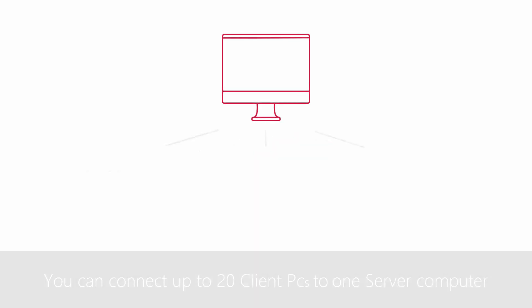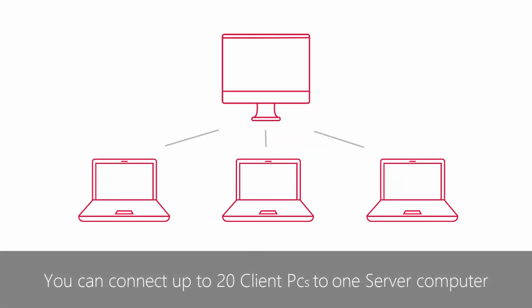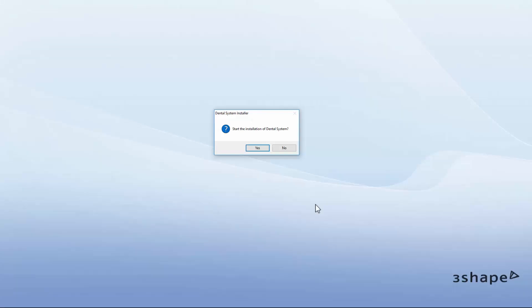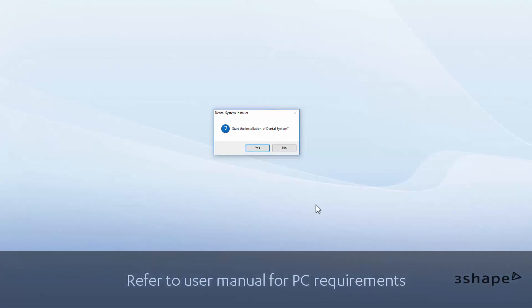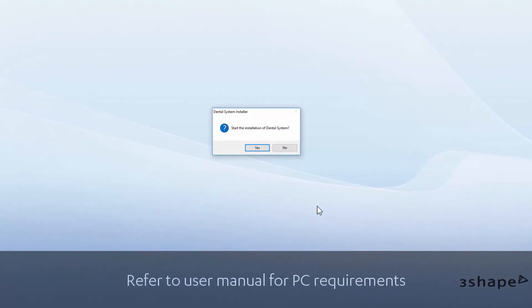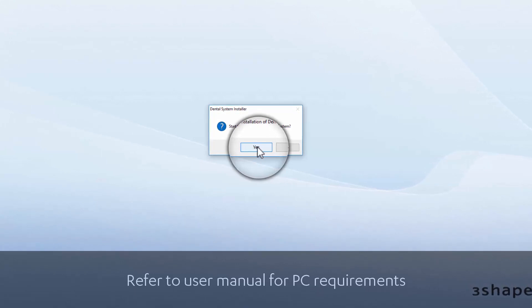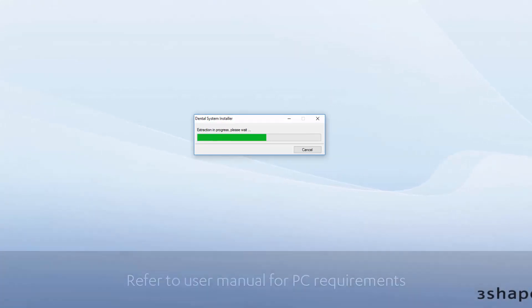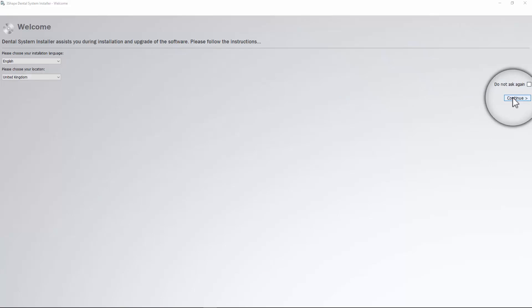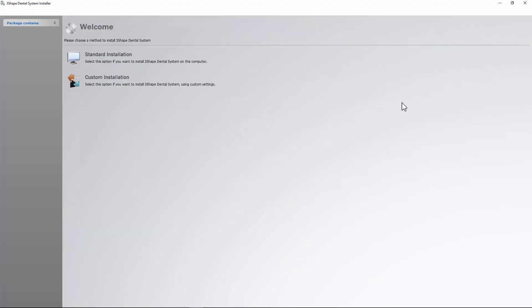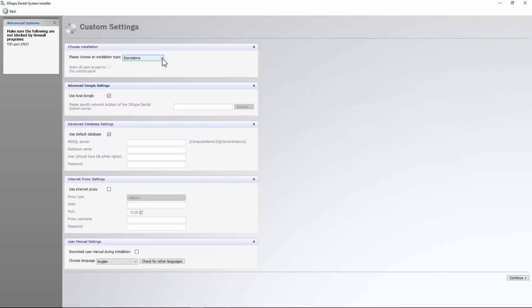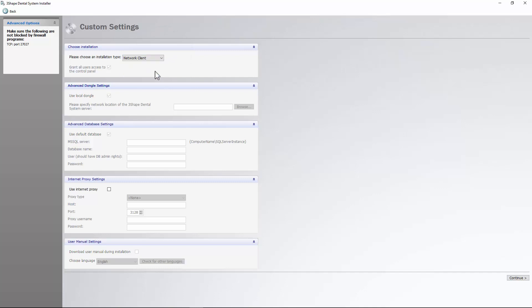After setting up an active server installation, you can create client installations. The amount of RAM and video memory on client PCs is important for design performance. Press Yes and wait for the files to extract. Choose the installation language and click Continue. Then select Custom Installation, Network Client from the drop-down menu, and click Continue to proceed.